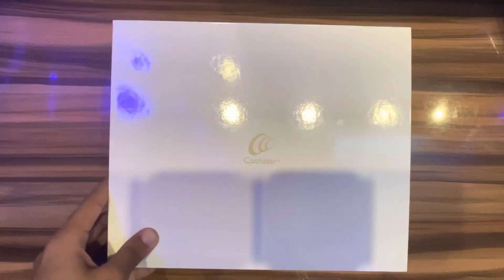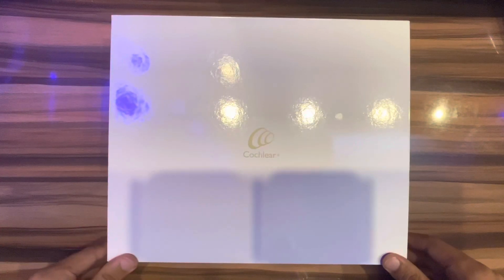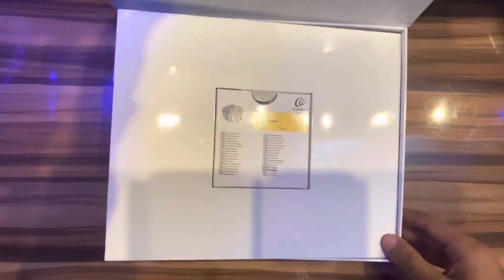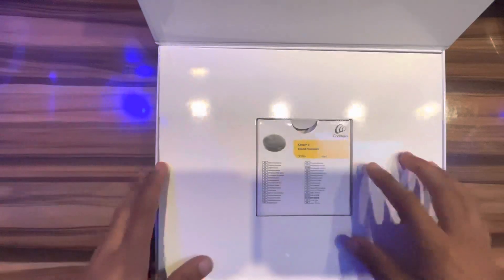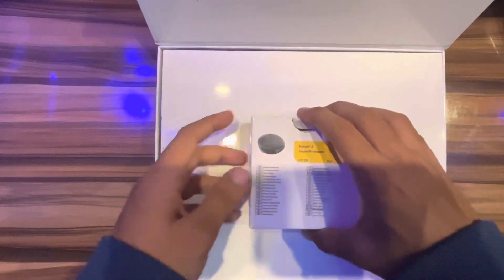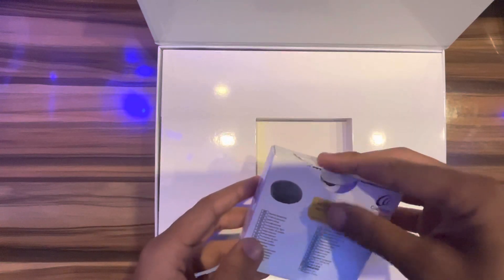Hello, welcome back to my YouTube channel. Let's do an unboxing of the Kanso 2 — this is a sound processor. I will unbox this now.